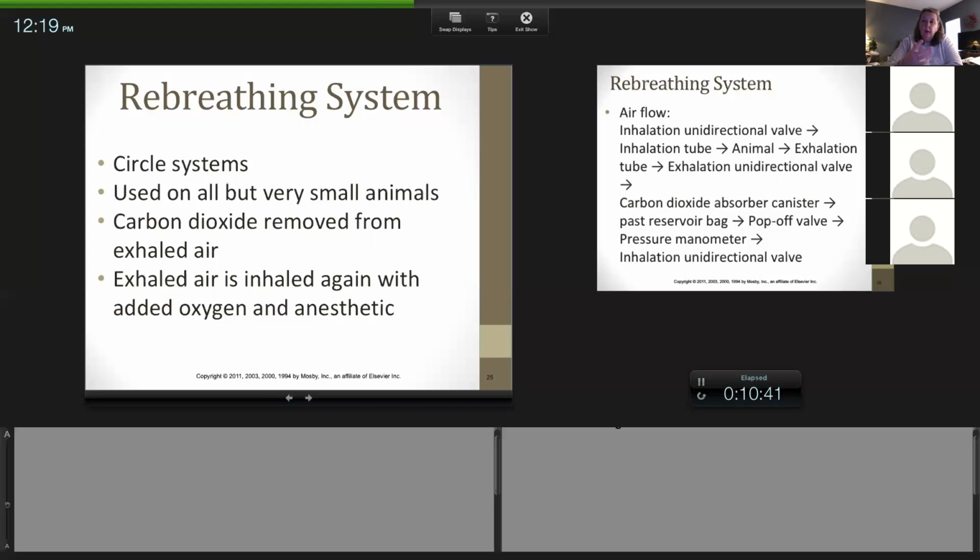So when an animal exhales, think of it this way. When they exhale, some of that gas goes out the scavenge. Some of that gas, obviously when they exhale, your rebreathing bag expands. So some of that exhaled gas is going in your rebreathing bag. In your rebreathing bag, what is going on?